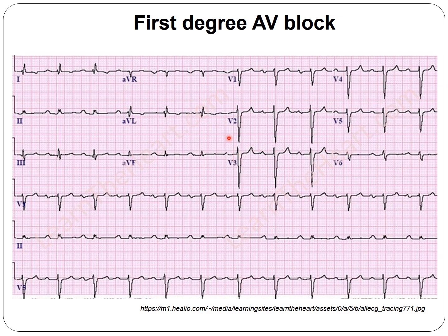Looking at this next graph, it's also rhythmic with a rate around 75. We see a positive P wave in lead 2 and negative in AVR, representing sinus activation. Every P gets conducted because every P is followed by a QRS complex. However, the PR interval is longer than normal.